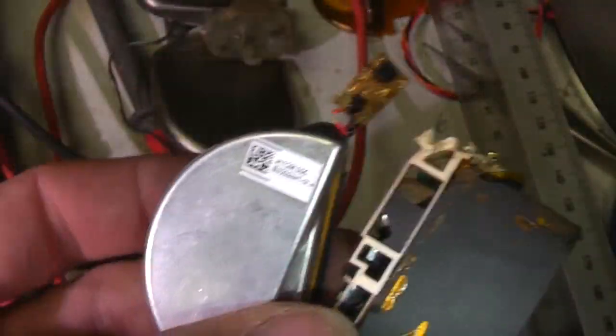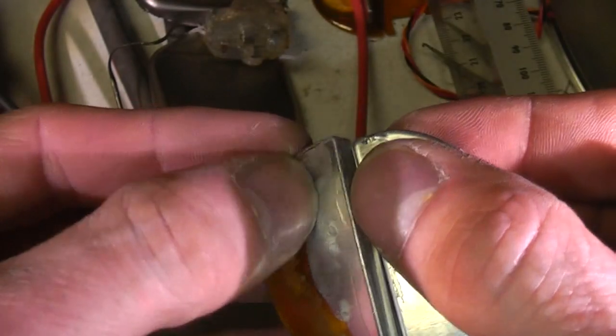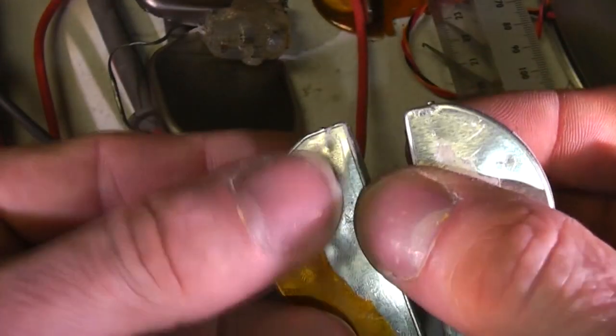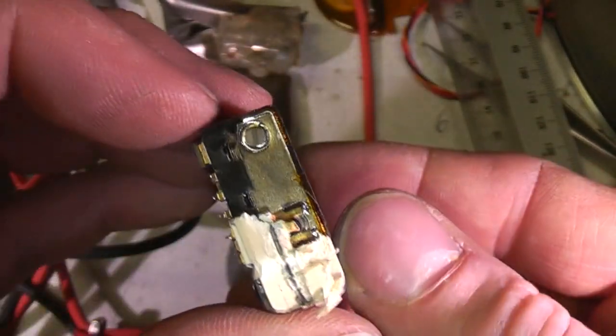Right, I've got most of the plastic off. I've got these two capacitors off. These seem to be a welded aluminium case. This denting is just the damage I did in the process of getting them off because they were glued in, so it's peeled the case open a little bit. The rest of it, we've got this board on top and then this back bit, which is the battery.